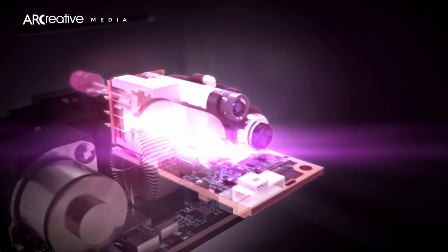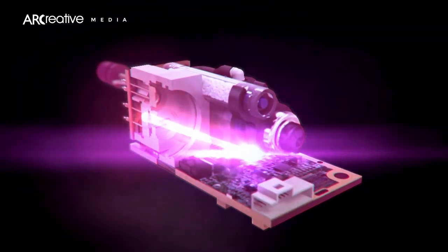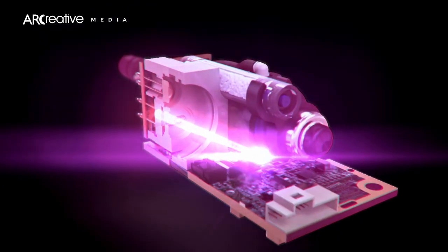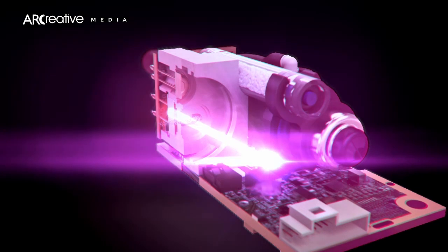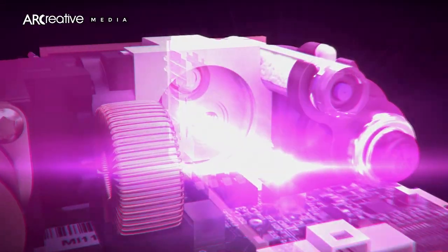Microstream technology uses a unique CO2 specific infrared light source that samples carbon dioxide presence in the exhaled breath, therefore not affected by the presence of any other gases.